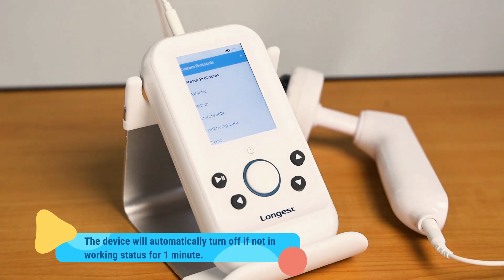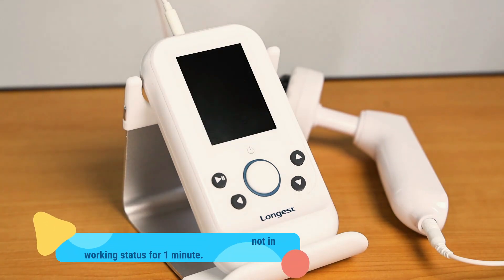Please note that the device will automatically turn off after one minute if you don't operate it or the device is not in treatment status. You will need to long press the button to turn it on again.